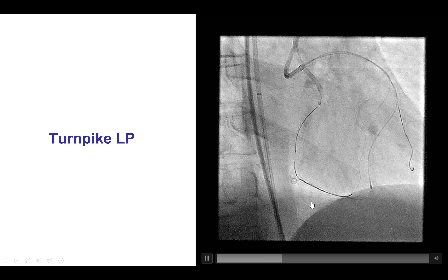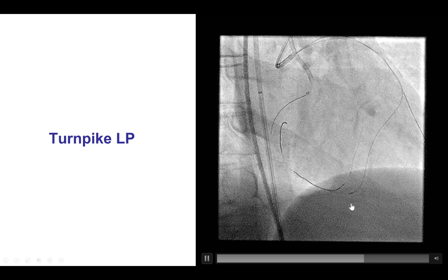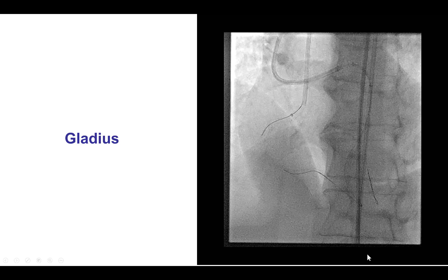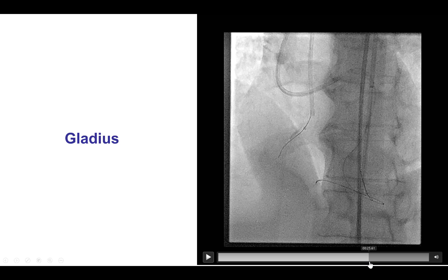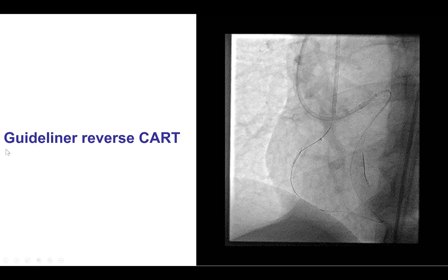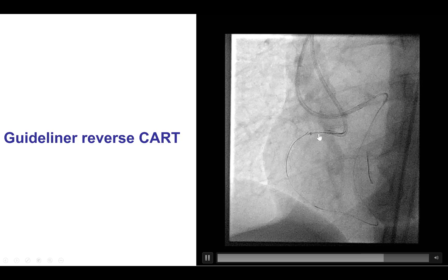The problem of the microcatheter-uncrossable septal was solved by using another septal in this case. After this was achieved, we used a Gladius guide wire to wire retrograde, and that wire made good progress advancing close to the mid-RCA and close to the antegrade wire in the vessel. We then performed a guide extension reverse CART — repositioning the guide extension multiple times until we were able to redirect the retrograde Gladius into the guide extension.